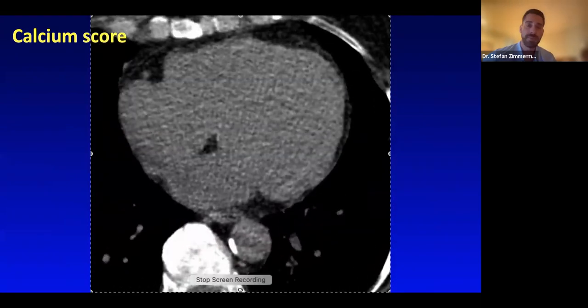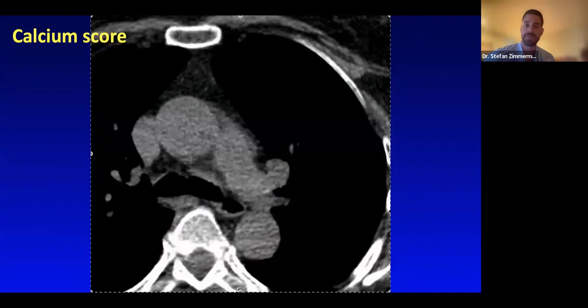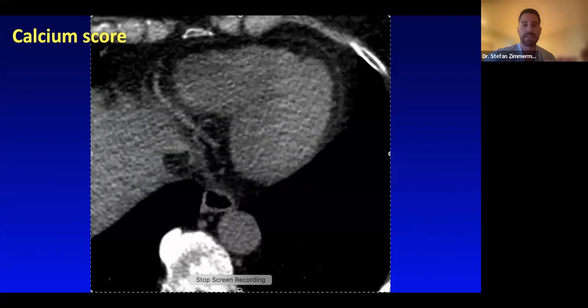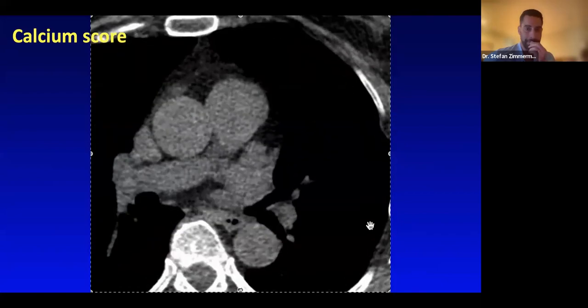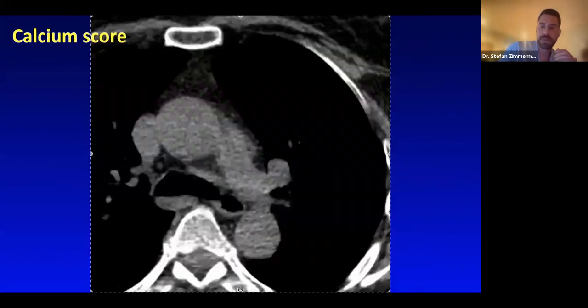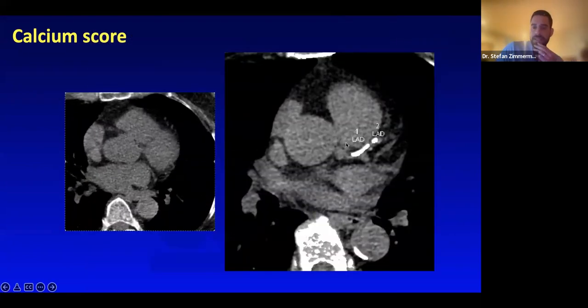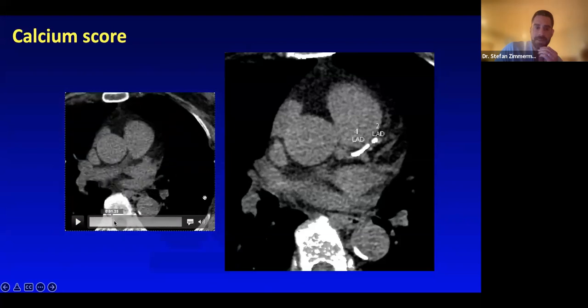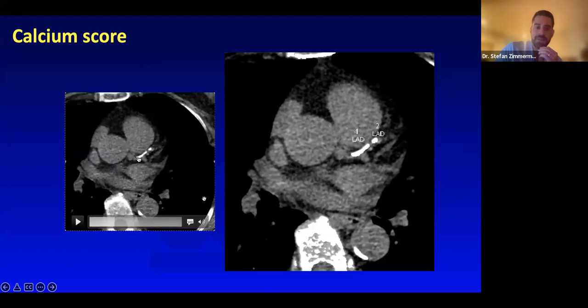So this is a really simple test. Here's some images in a patient from a calcium score. In this case, this patient has a little bit of calcium in the LAD here, and it's these bright areas that we see show up at the top of the image. Let me see, right there. So that's called calcium. You notice it's about the same brightness as this area here.